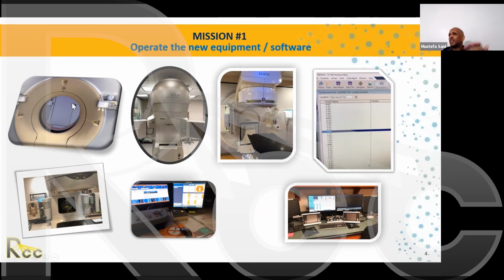So you have a new CT machine. Know the CT machine, how to run the CT machine. For example, when you scan, you have a patient lying down. It's a pediatric patient, a small patient. Start practicing ALARA.